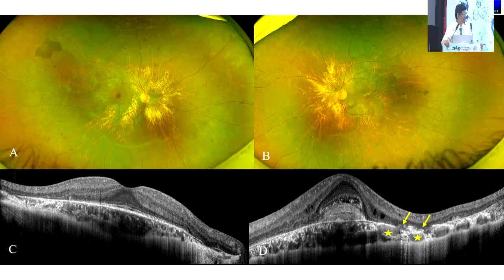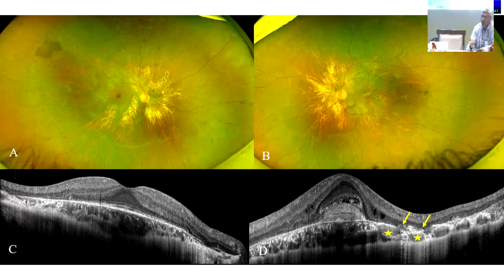So do we expect more of a myopic eye or a leptochoroid kind of picture, or so much of a pachychoroid-like picture, sir? I really haven't done OCT to show what exactly happens in choroideremia, but of course there is a thickening of the choroidal layer here. You are not expected to have a thickened choroidal layer in choroideremia. It should be thinner. And this is not a classic choroideremia in that sense, and the patient is very young, isn't it? Yes, sir. So it's probably an evolving disease is what I would think.